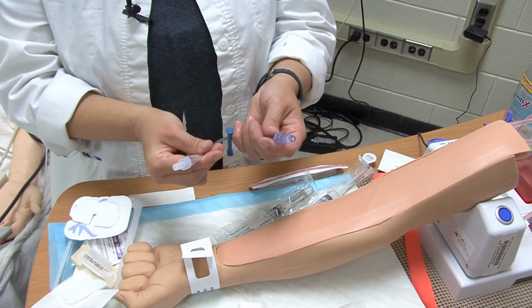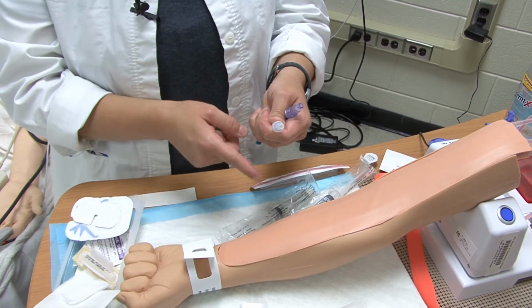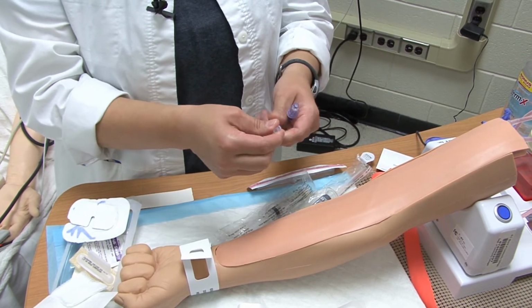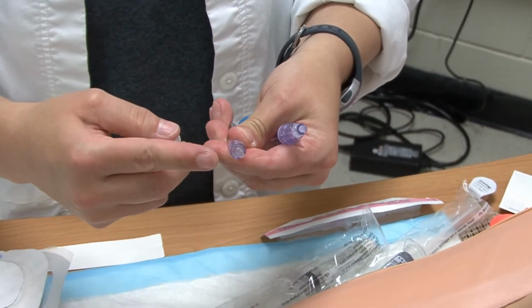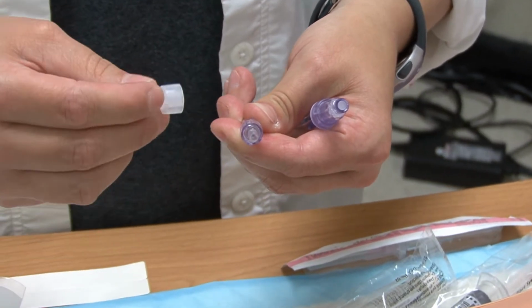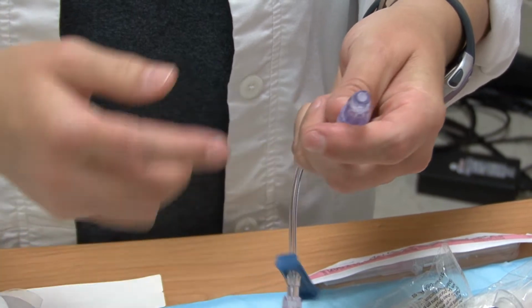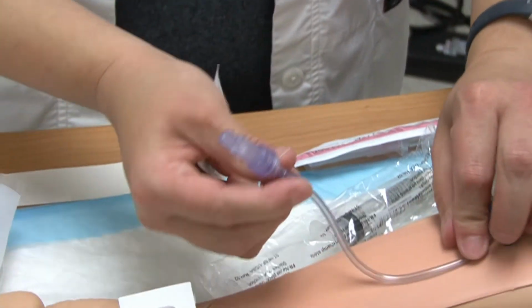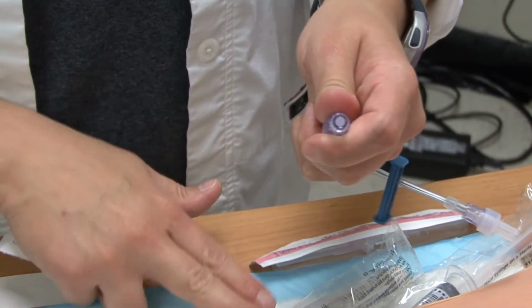But just to make sure you can see the difference, this piece right here is the piece that actually attaches to the hub of the catheter that's going to be inserted into the patient. And it looks like this. So this is the piece that you want to make sure that you keep sterile. And if you touch it, then you'd need to swab it with alcohol. But you definitely want to try to keep it sterile. This is the piece that hangs outside of the patient, and you would need to swab it every time before you go to flush it.